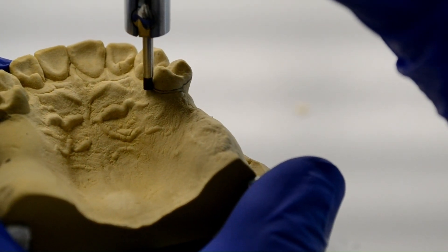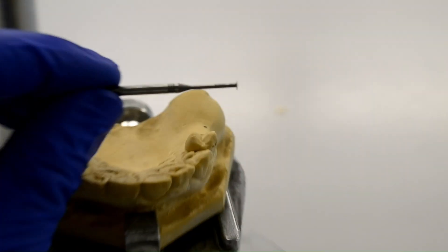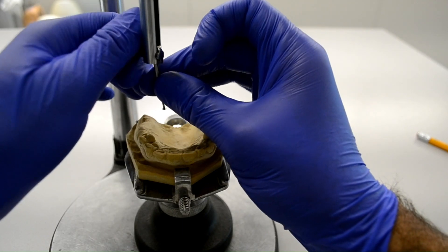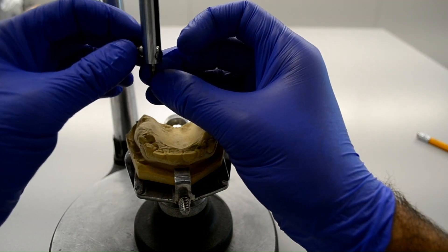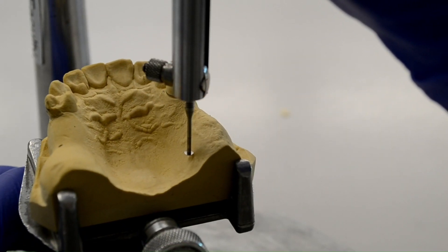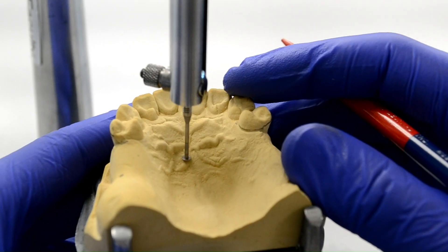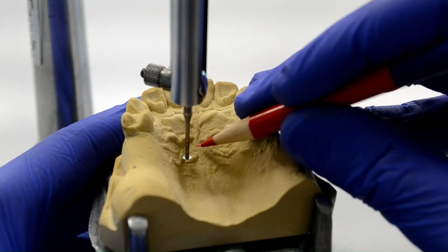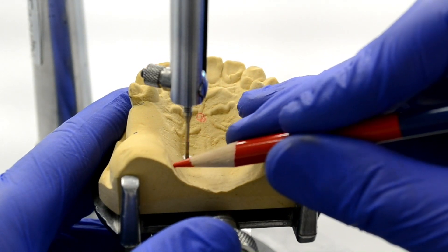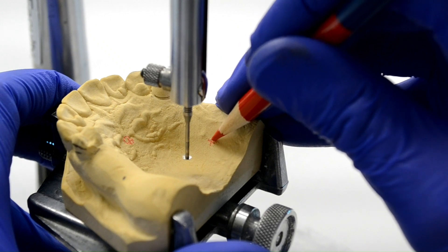With this, the surveying is completed, but in order to save the position of the cast, we need to tripod it. This is done using a 0.03 undercut gauge. The 0.03 undercut gauge is attached to the mandrel and the mandrel is lowered so that the undercut gauge can touch the cast at three different areas without having to move the mandrel up and down. A red pencil is then used to mark each area of contact at three different points on the cast, and red circles are added for easier visualization.